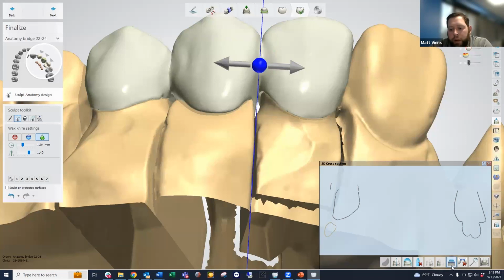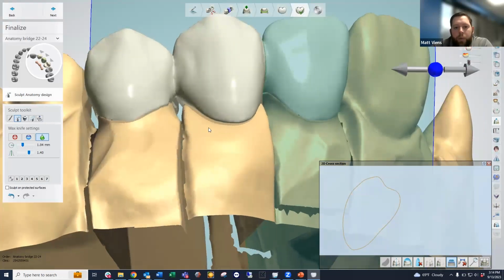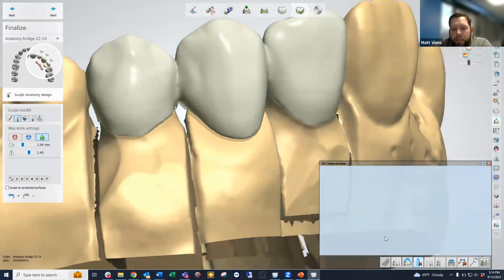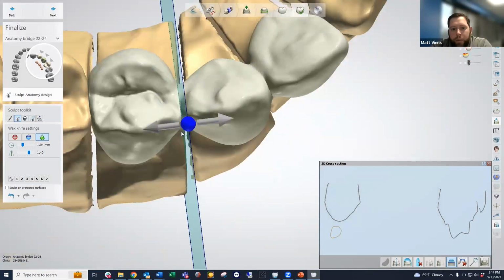And then there's a measure area portion. The measure area portion allows us to view that specific cross-section and measure the overall squared area of that cross-sected area. Again, if I wanted to check this one, I'm going to remove my cross-section that I did along the lateral and the cuspid, and dissect this area along this cross-section here. Again, click on this little square tool, which shows the area. And we can see that one is a little underdeveloped, so maybe I need to build up that one a little bit more.